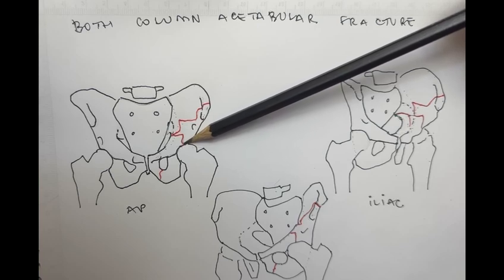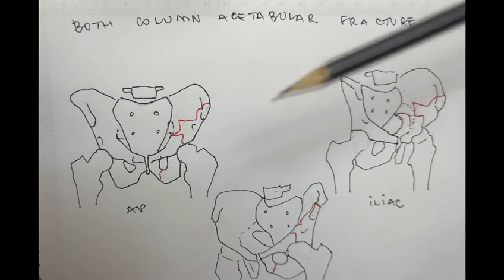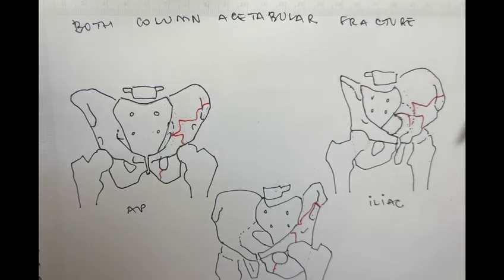There is also another anterior column fracture here, and the ramus down here. In the iliac view, we can again see the fracture running from the iliac bone, coming down, and we have this typical spike here. Sometimes there is a separate triangle fragment here. Again, the anterior column fracture coming to the quadrilateral surface here, and also the posterior column.